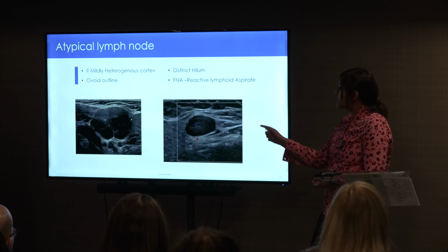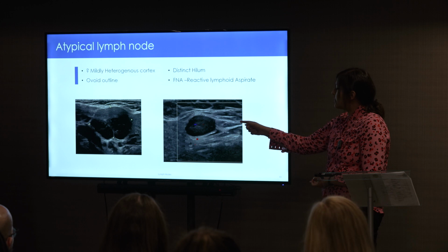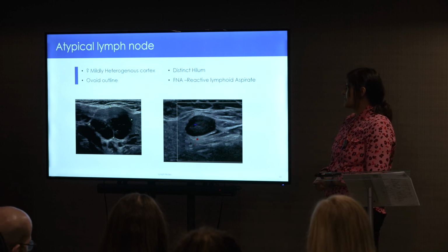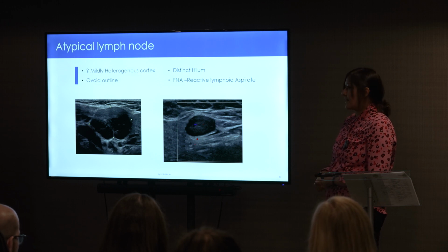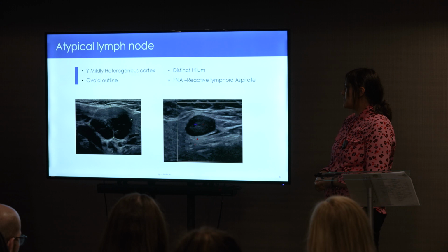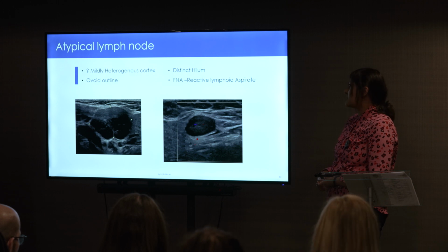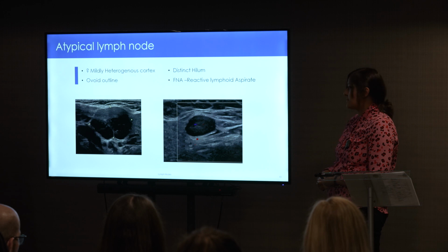So for the left-hand, right level 2 lymph node, the patient just had this isolated lymph node and came back for a repeat surveillance scan. I just went ahead and did a core biopsy, and this came back as a low-grade lymphoma, despite being a reactive lymph node a few months prior. So just always correlate with the clinical history, and luckily the clinicians were on the ball with this one.